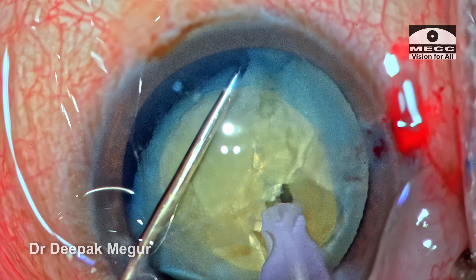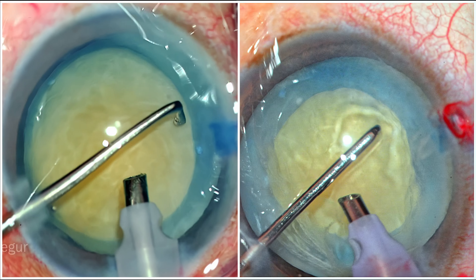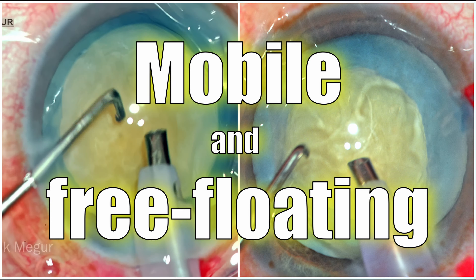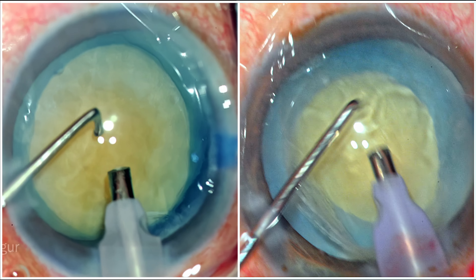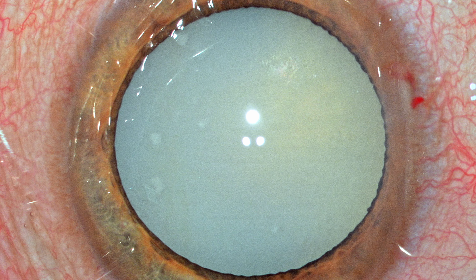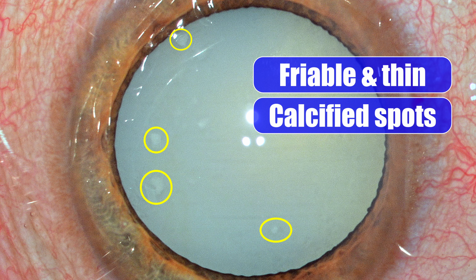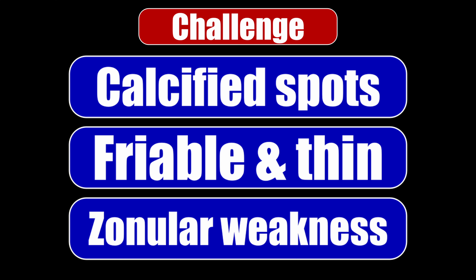Horizontal chop in a Morgagnian cataract — that's what we're going to discuss in this video. Hypermature cataracts are challenging simply because the nucleus is mobile and we don't have the cushion of the epinucleus and cortex. Many of these hypermature long-standing cataracts also have a problem with the capsule. The capsule more often than not would be very friable, thin, and could have specs of calcification, as we have here. Along with that, we could also have zonular weakness. So these are the points to consider when dealing with these cases.